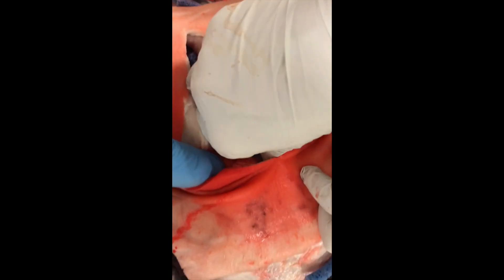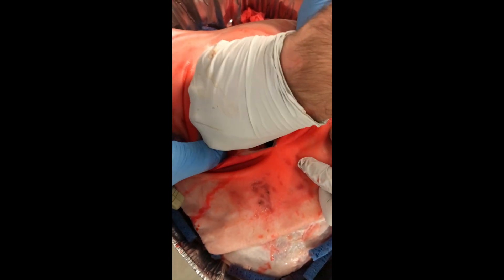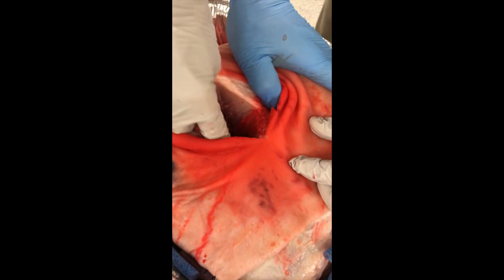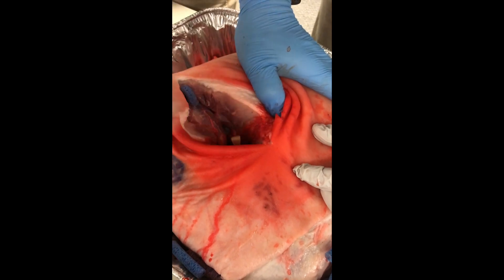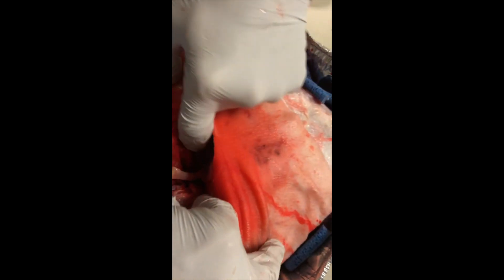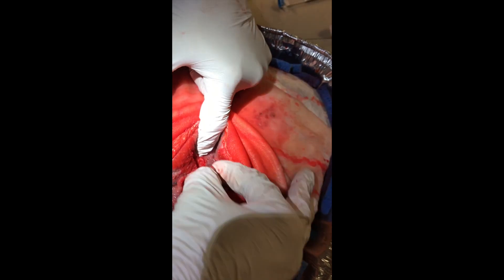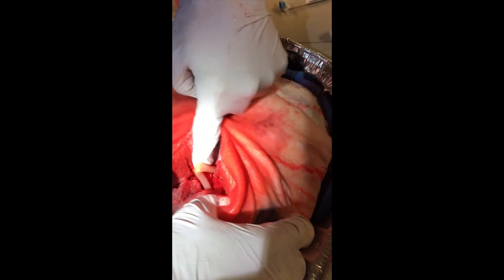There's still more coming — a lot of those things in there. They're actually taking up the space; they went all around it and pulled it up, just like they're designed to do. Look at that one — still in there. That one actually went down a wound channel. That's pretty good. There's another one tucked under there too. Followed the tooth through the hole.